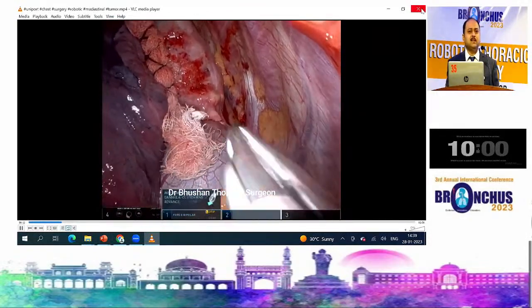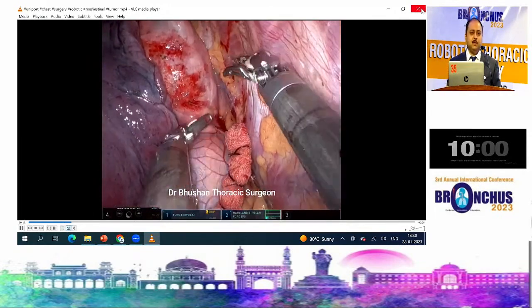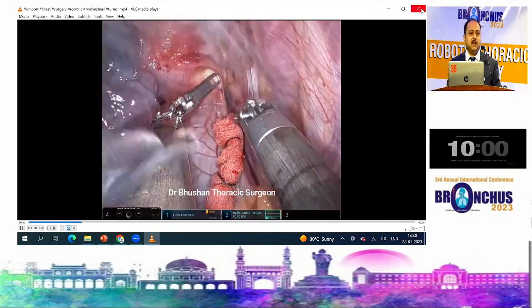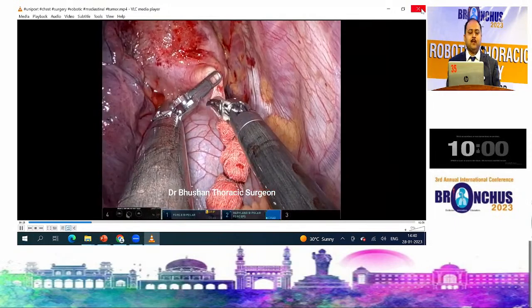Dr. Bhushan. Hi, Dr. Abhishek. That was a wonderful presentation. Which suture have you used in plication? Ethibond. Okay. Polypropylene and felt pledgets. Ethicon, you get pledgets.